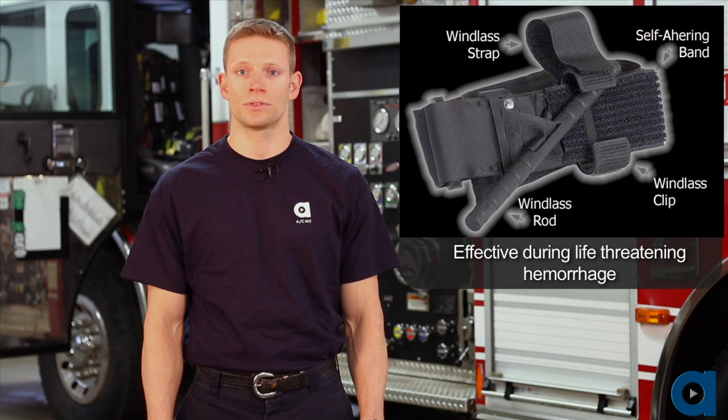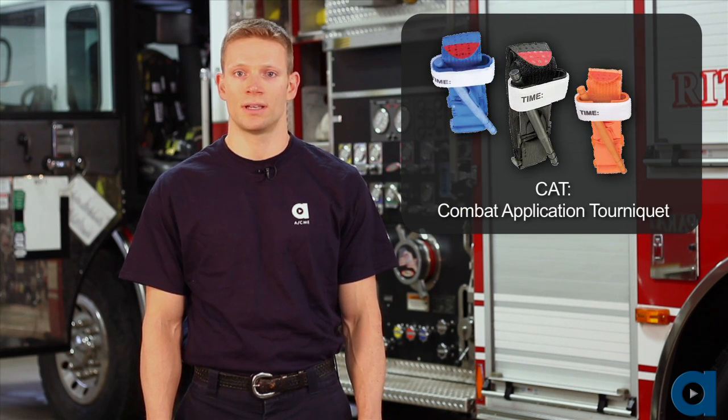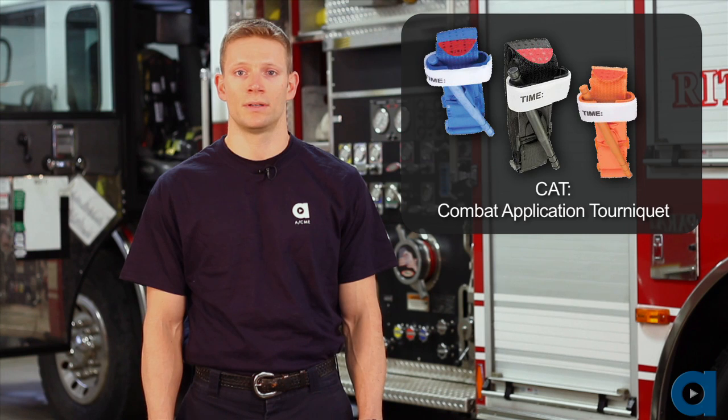If direct pressure fails to control severe bleeding, the decision to apply a tourniquet should be made quickly. The Committee for Tactical Combat Casualty Care currently recognizes the Combat Application Tourniquet, or CAT, as an effective device for controlling severe life-threatening hemorrhage from an extremity wound.